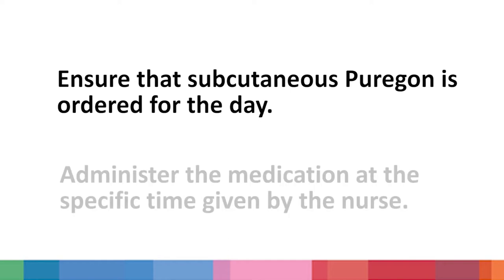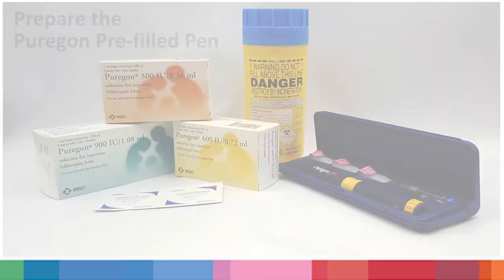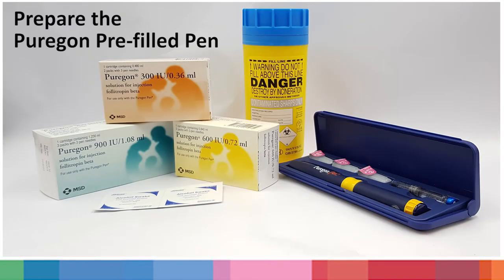Administer the medication at the same time each day. Practice proper hand hygiene by washing your hands with soap or use a hand sanitiser. Next, prepare the following items: 1 Pyoregon pen, 1 Pyoregon cartridge. Inspect the medication — ensure it is clear with no particles and that it is not expired. Also prepare 1 single-use needle, 2 pieces of alcohol swab, and 1 container for disposing the injection, such as a disposable plastic bottle.